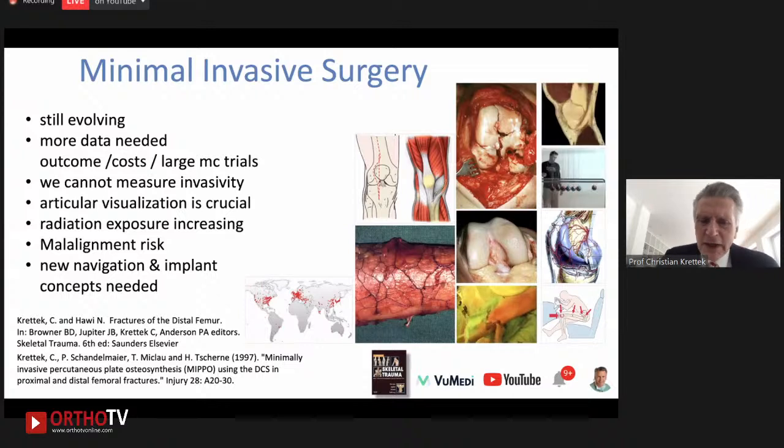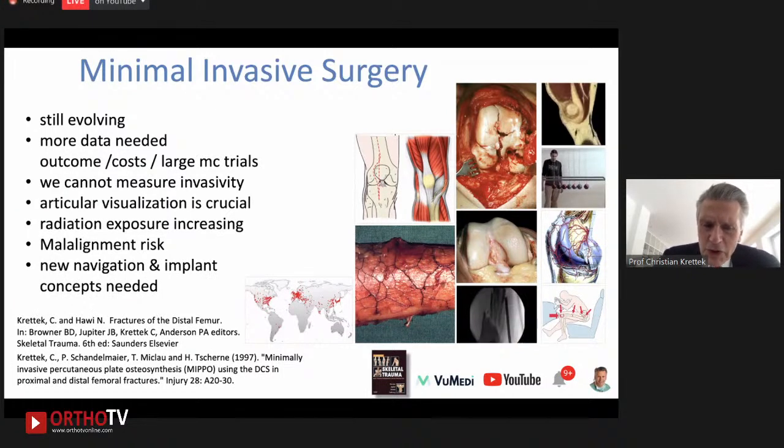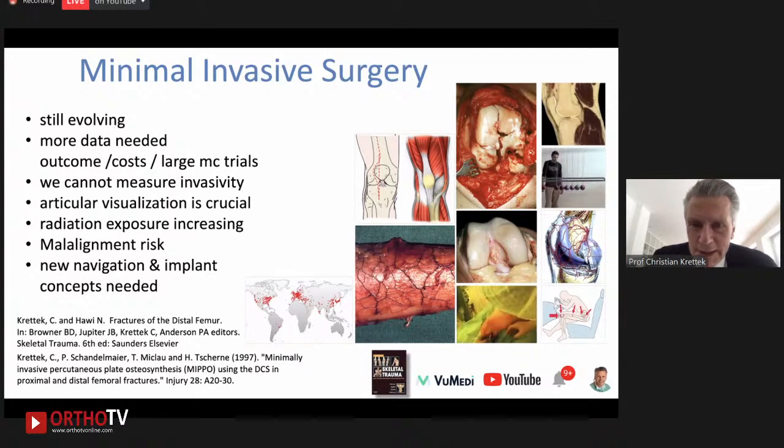invasivity. Really crucial for articular management, fracture management. Still today, radiation exposure is increasing. There is a higher risk of malalignment, and new navigation and implant concepts are needed in order to get further improvement. Thank you very much for your attention.